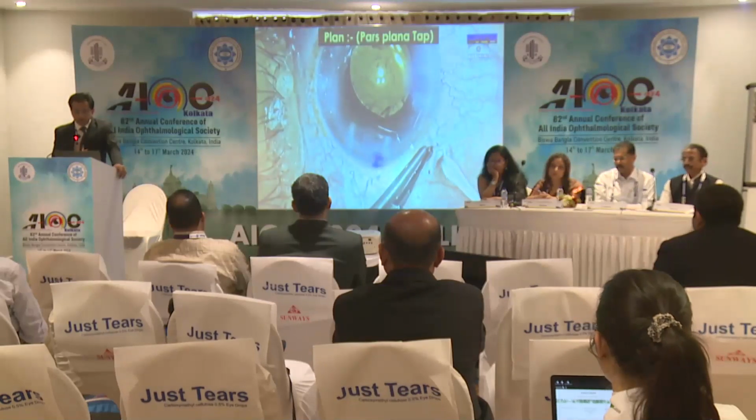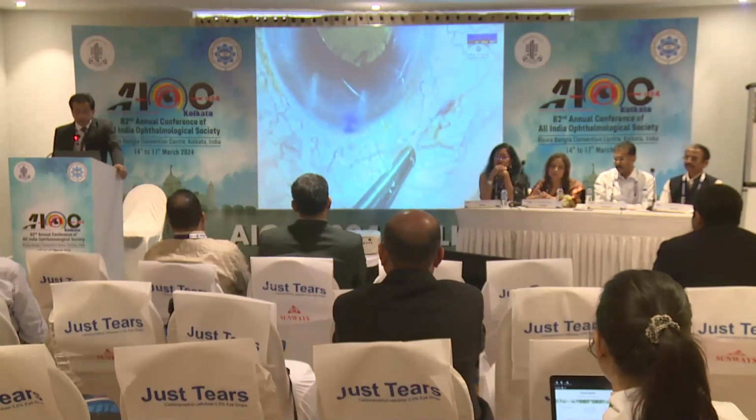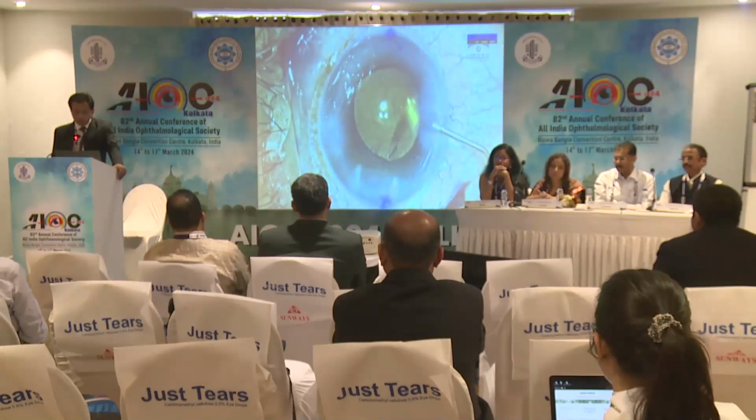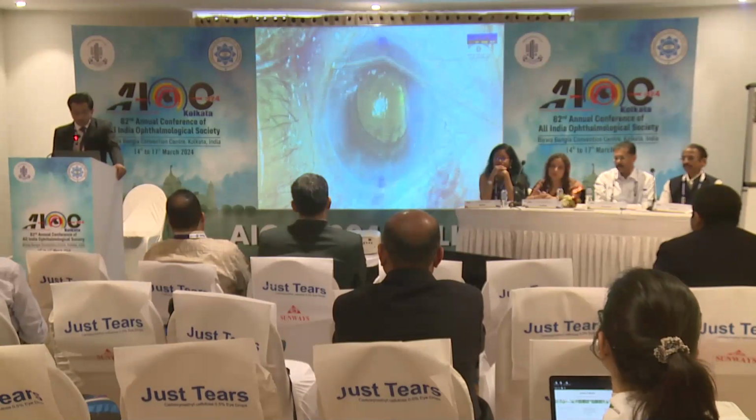I couldn't align the lens. I thought because the B scan was normal, I did a pars plana tap, but nothing came out. And this was an alarm for me. I just sealed the wounds, closed all the incisions, and then again, as expected, took him back to the B scan.